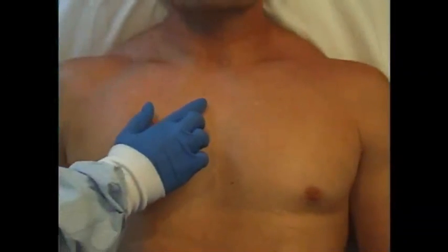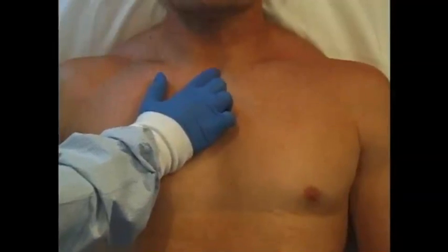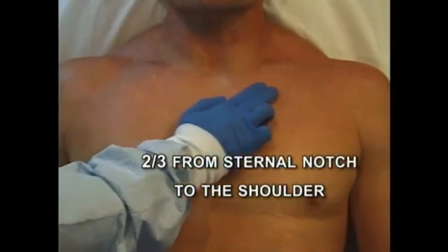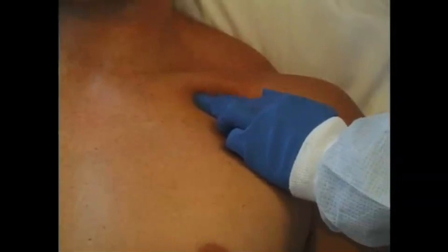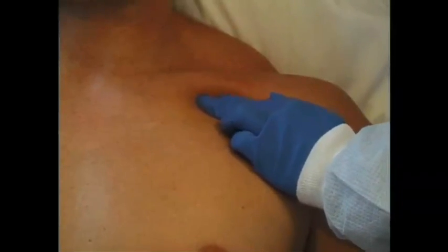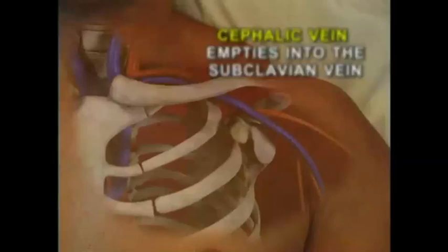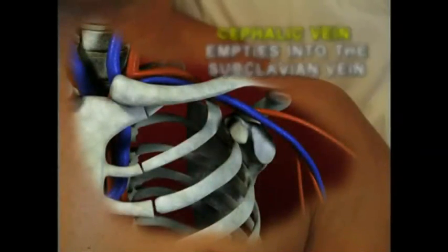The landmarks for subclavian line placement are the point on the clavicle that is two-thirds from the sternal notch to the shoulder. This area may also be noted by finding the deltopectoral groove in between the pectoralis major and the deltoid muscles. It is in this groove that the cephalic vein runs and empties into the subclavian vein.